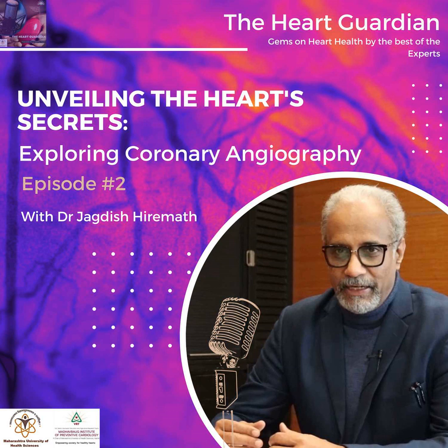CT scan visualization of coronaries non-invasively is also a method of coronary angiography, but that's a different subject of discussion. Because conventional catheter angio is invasive, it involves X-rays, contrast, hospitalization and expenses. It is reserved as a last test like the Supreme Court, and it's not a routine examination.